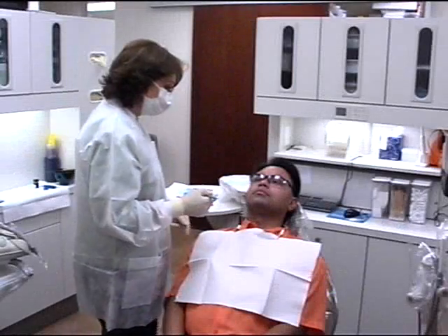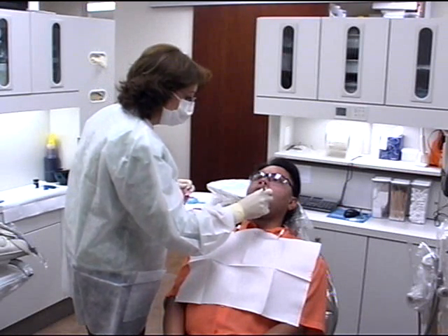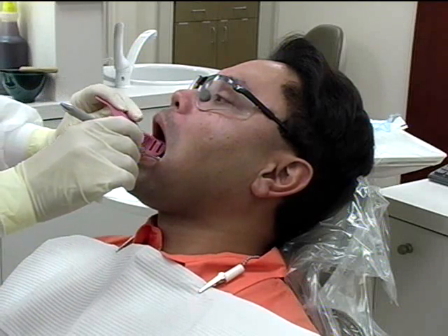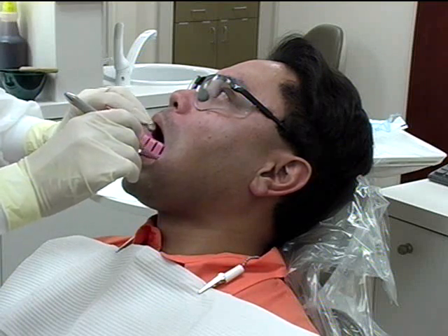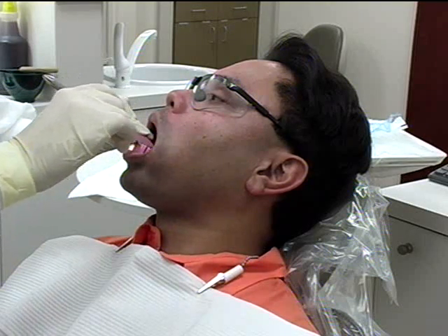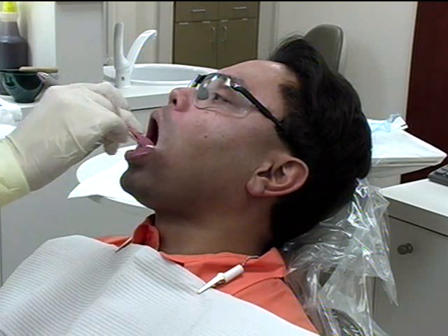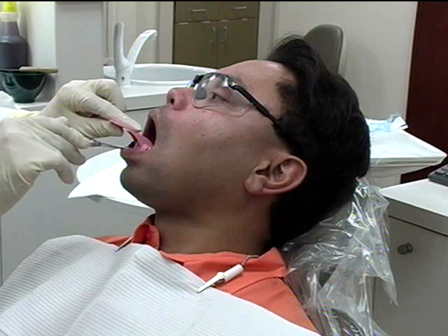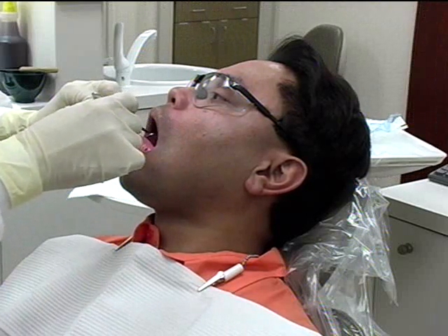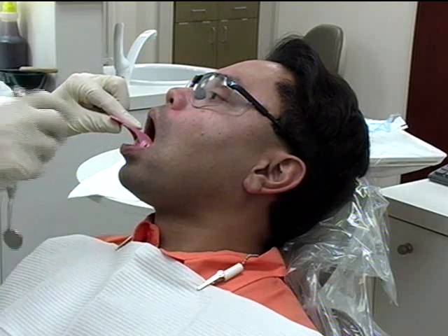To select the mandibular tray, stand in front of the patient. With the mirror in the right hand, retract the cheek. The left hand should rotate the tray as it is inserted in the patient's mouth. Check for tray extension. The tray should cover all the teeth and the retromolar pad, and about 6 millimeters from the raised flanges of the tray. Properly selected trays allow 1/4 inch or 6 millimeters clearance.